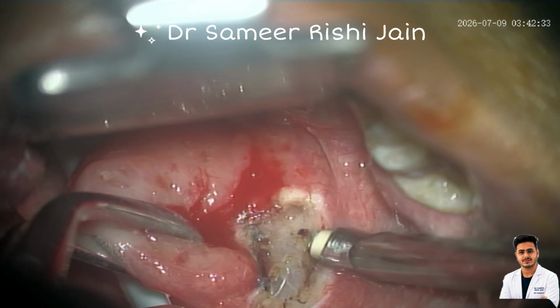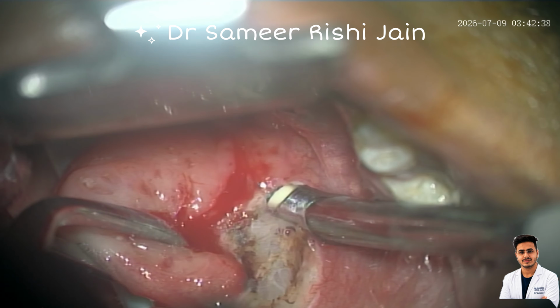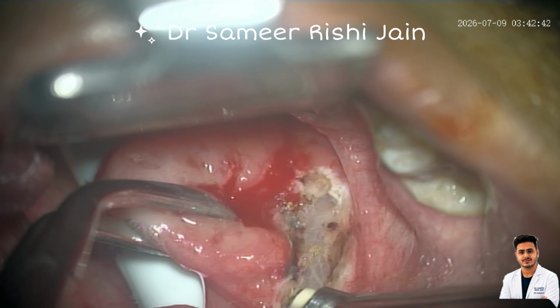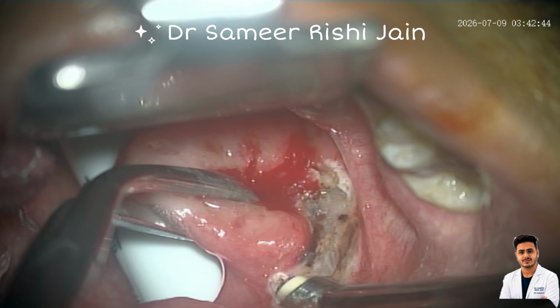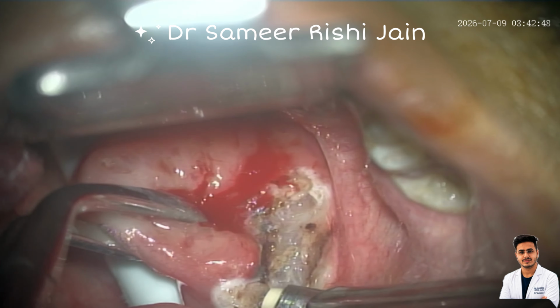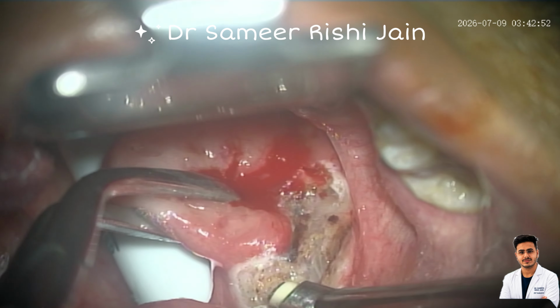We are holding the right tonsil with the help of an Ellis forceps, and we are incising the mucosa with the help of the wand. We are using the ablation mode for the incision. We are incising just lateral to the anterior pillar.